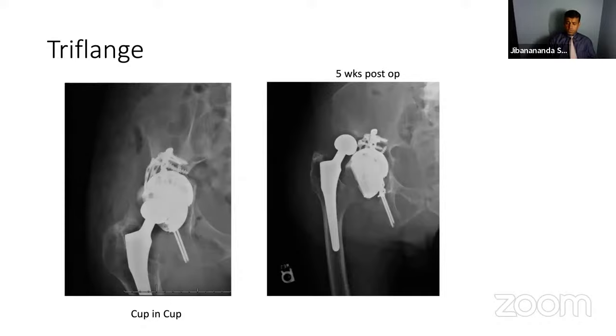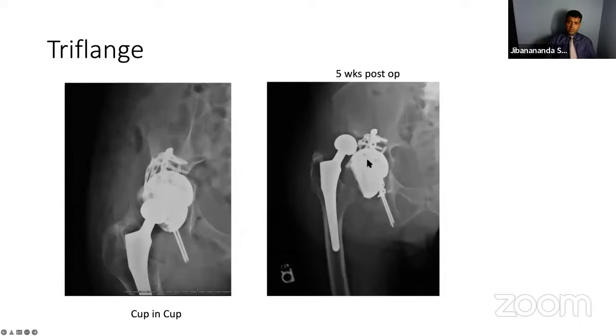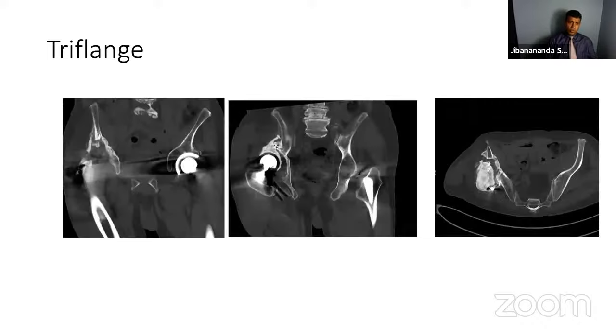It looked good. It was stable intraoperatively, but unfortunately, it did dislocate. As you can see, post-op, he came back 5 weeks post-op and said he might have dislocated a week or two ago. At the time, he was taken back to the operating room, but there was concern for infection. So the implants were taken out and a spacer was placed instead. Cultures actually were negative afterwards. But at this time, the bone loss is severe. There's really not much to reconstruct here.